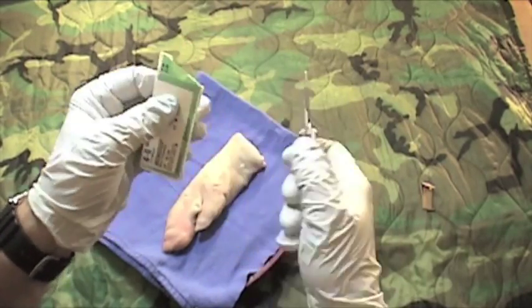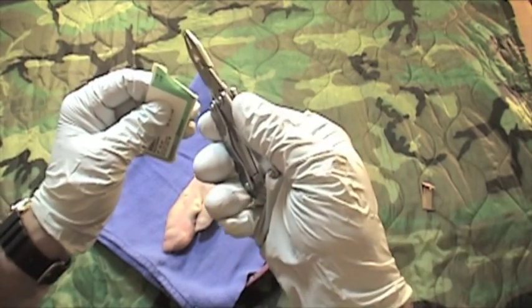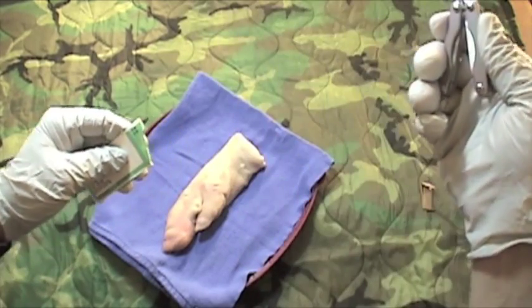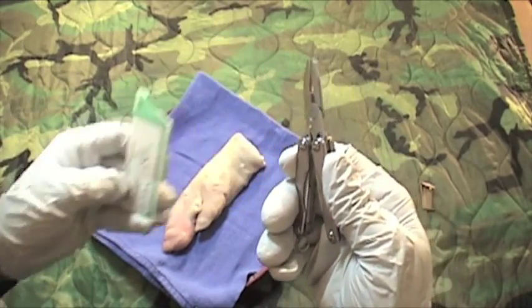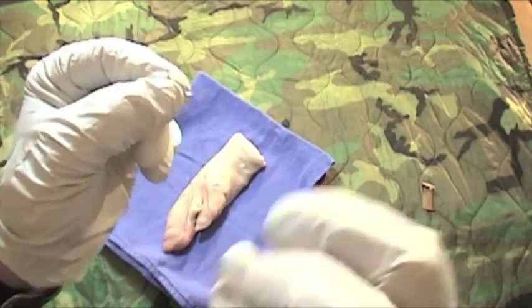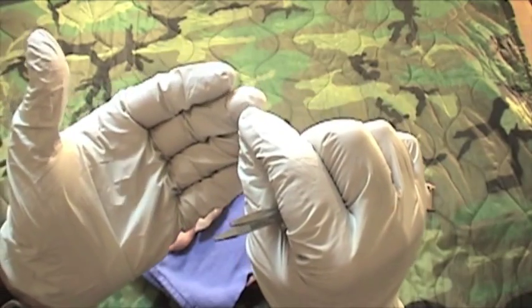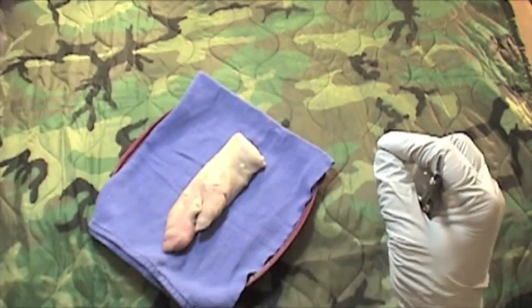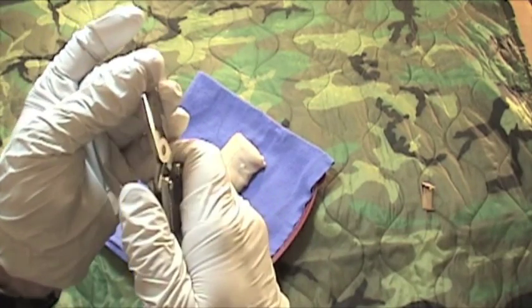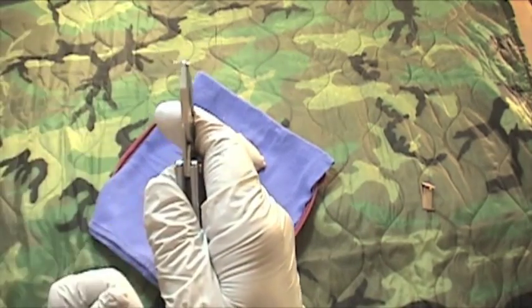The way you do this is you grab this suture needle with your needle driver — in this case the Leatherman Squirt P4 — and you just pull up and out, and you now have an empty pack. Let's take a look at what we have on the business end. There's a needle, and a long, perhaps two-foot piece of monofilament. It looks basically like monofilament fishing line, and it's permanently attached to this needle.